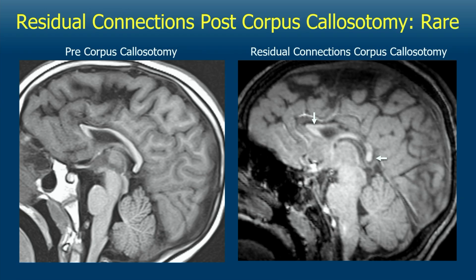In most cases of corpus callosotomy, there are no residual connections following the surgery. This is the one and only case that I've come across where there are residual connections in the front and the back part of the corpus callosum, and this child had surgery outside of the United States. So this is a really rare occurrence.